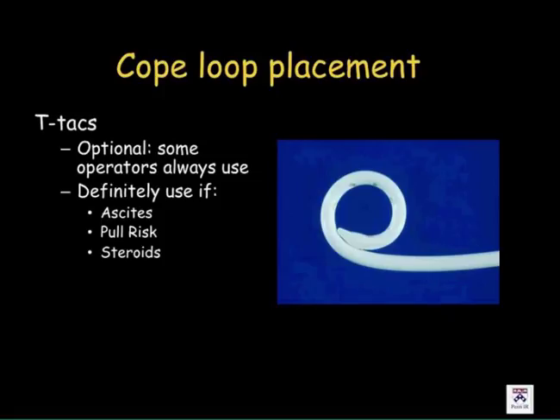Why? Because 7 years ago an article was published that showed that a small diameter gastrostomy tube caused more complications such as occlusion. Makes sense. And since then, I switched to the large gastrostomy tube, 18 French. It's exactly the same as the 14 French standard Mallinckrodt set, but it's called, I think, Deutsch.